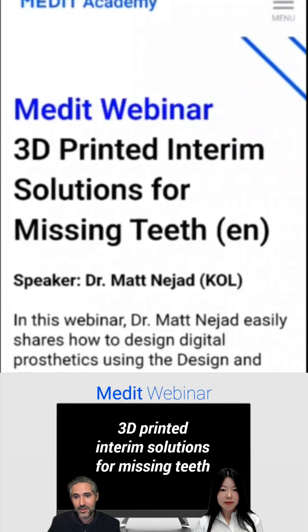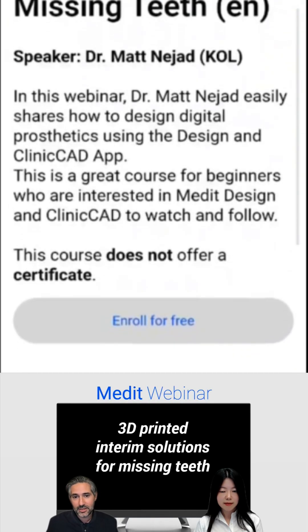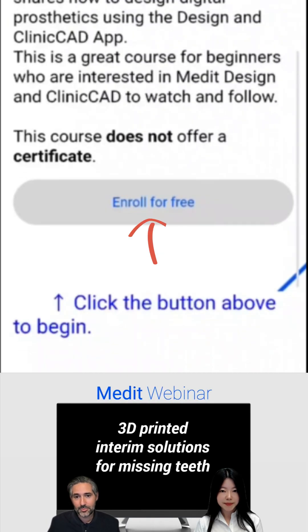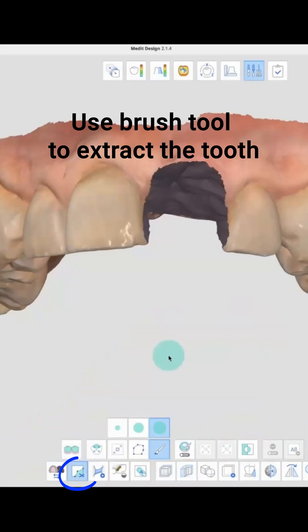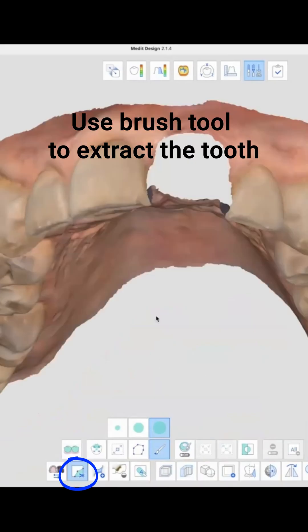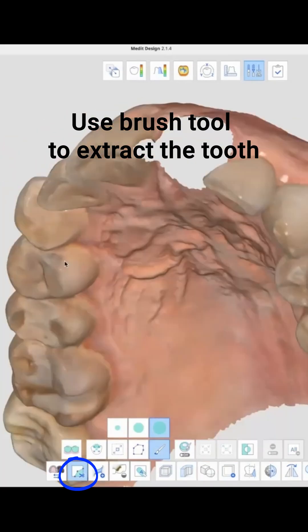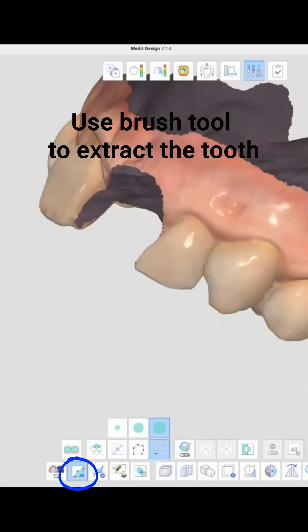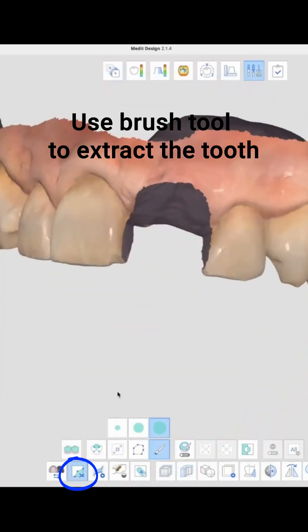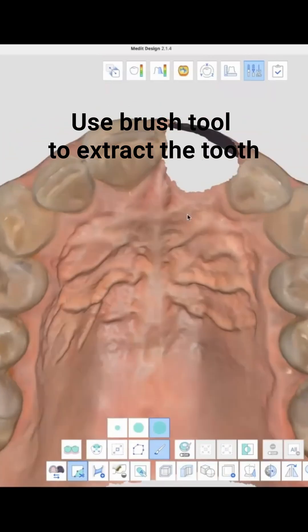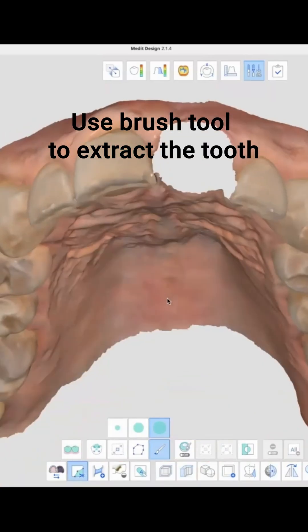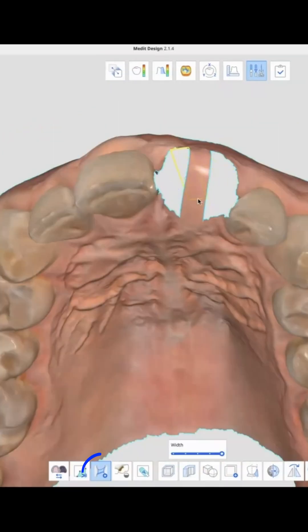So in today's webinar I'm going to be talking about this — I'll press delete here and remove that tooth. So we have our extracted area, but we need to close that hole.